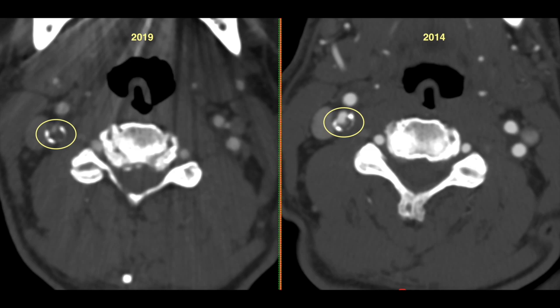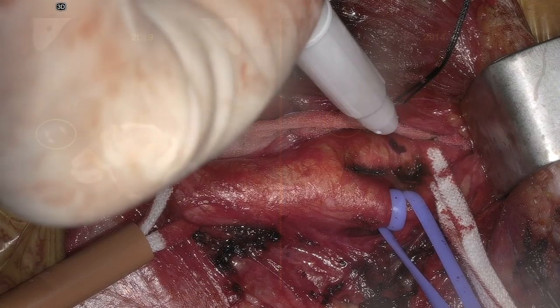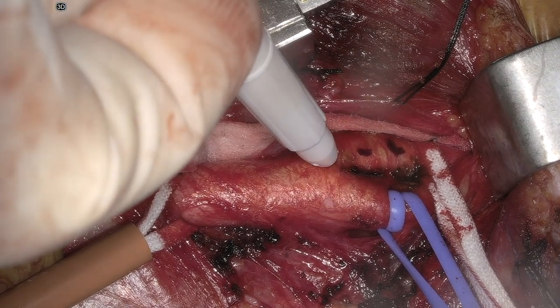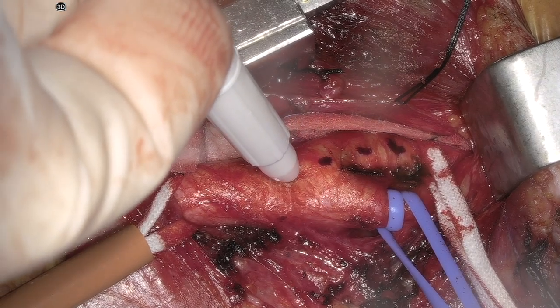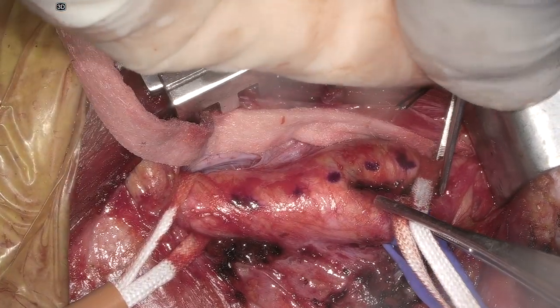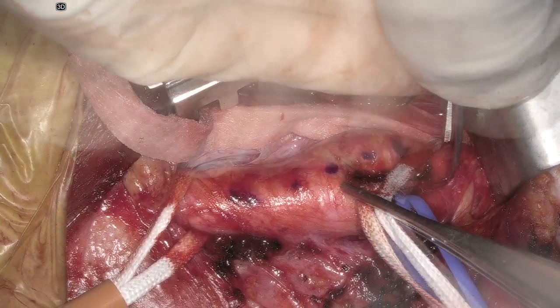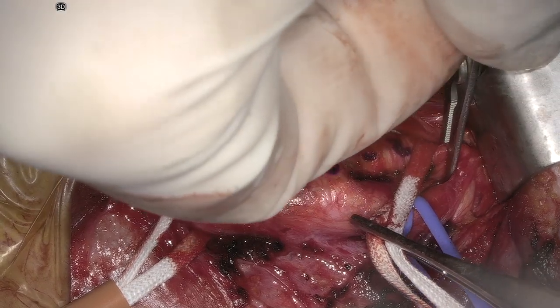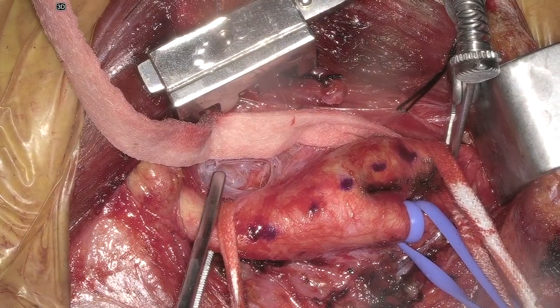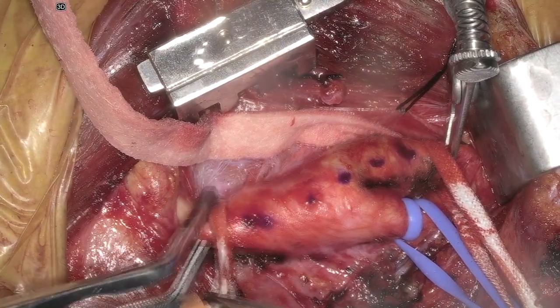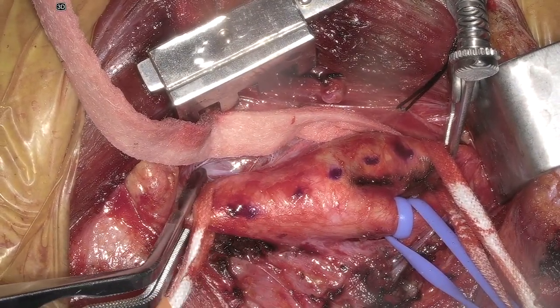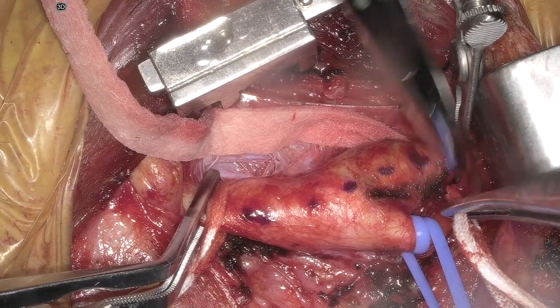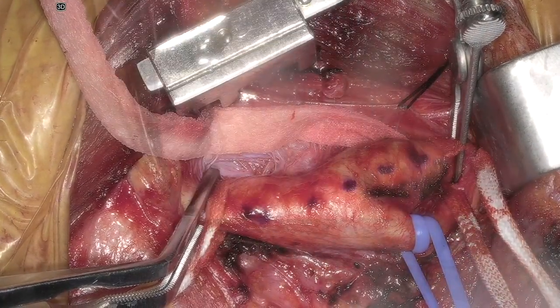Here's the right-sided endarterectomy where we mark the arteriotomy. We place Rommels as well as vessel loops around the external. We clip the internal followed by the common and external. After monitoring was stable, I took the vessel loops off since a shunt wasn't necessary.